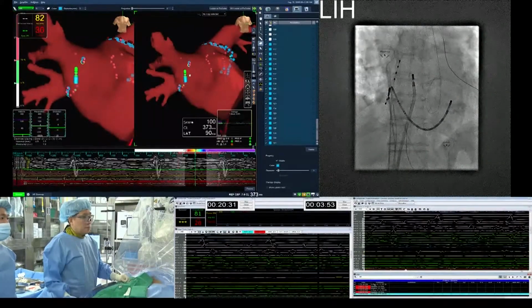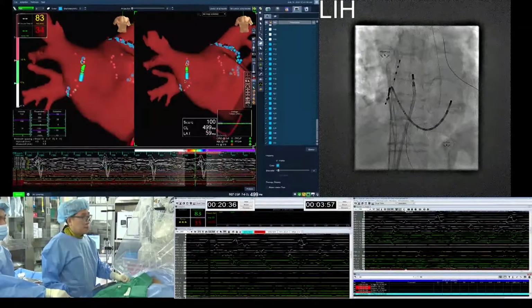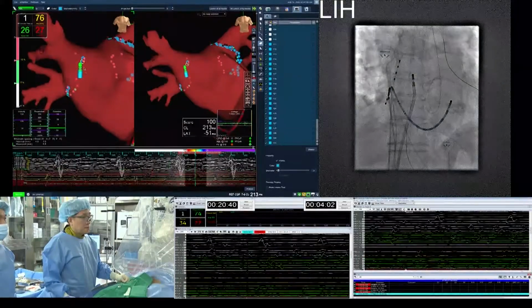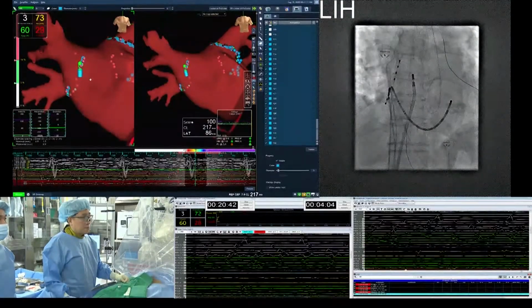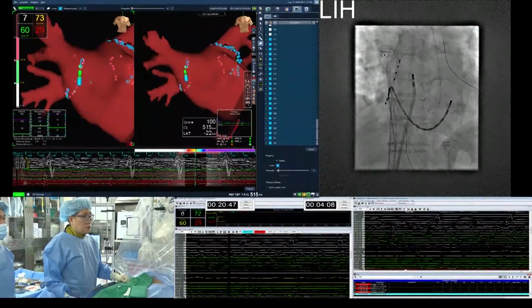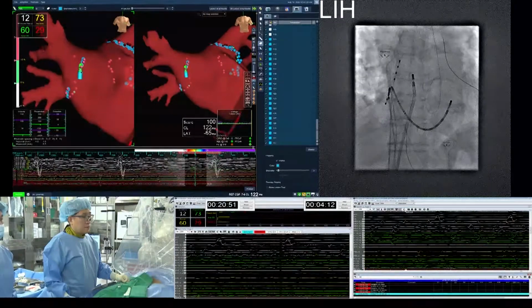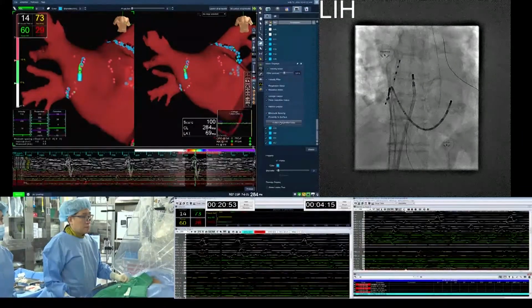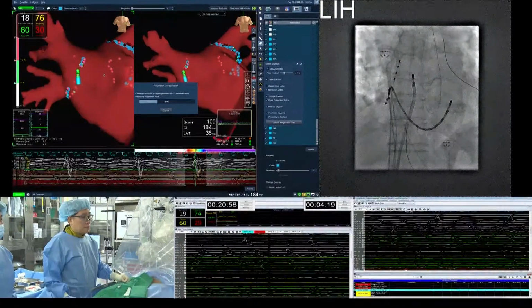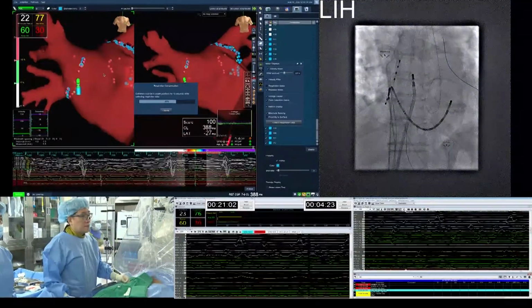So at this point, you need to rotate your catheter and sheath clockwise together. And please make sure your sheath is inside the transseptal site. Sometimes the sheath is outside of the left atrium and only the catheter is inside. In that case, even though you rotate the sheath vigorously, you can't make a good contact, and the catheter tip moves away from the endocardial surface.